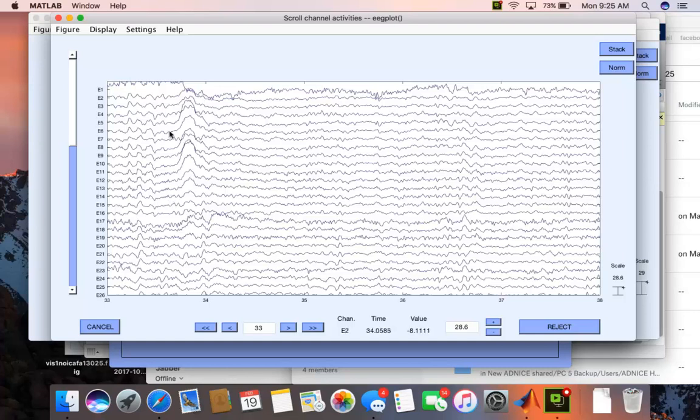Secondly, if I have a lot of these, then the presence of these in themselves will be averaged into the power spectrum and it'll skew it slightly. So I'm looking at a power spectrum of not just an EEG, I'm looking at a power spectrum of an EEG with these eye movements or muscle twitches or heart rates or whatever's in this data averaged in. So that's the problem with a purely frequency domain analysis.